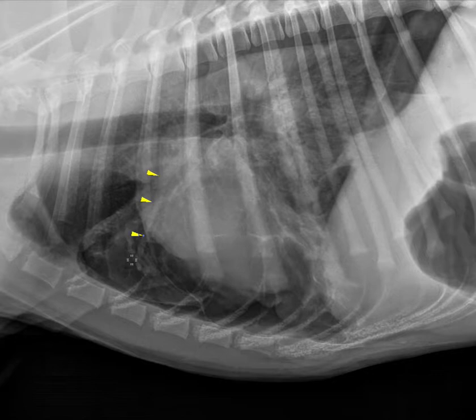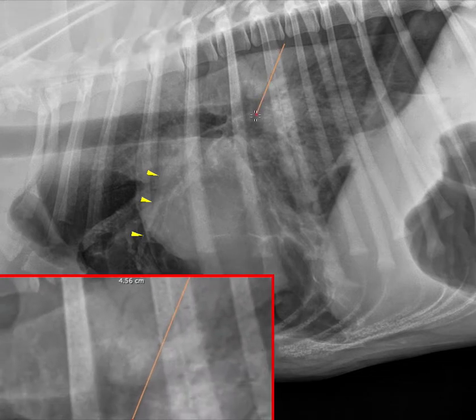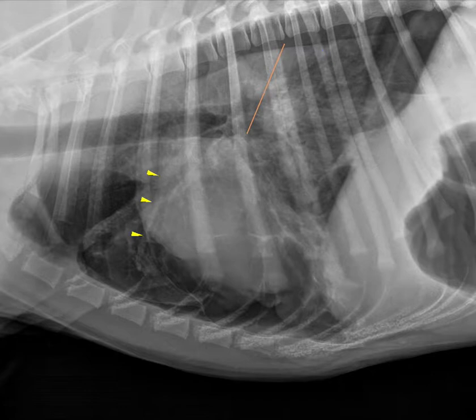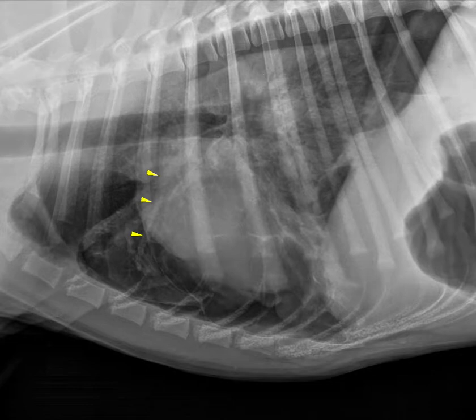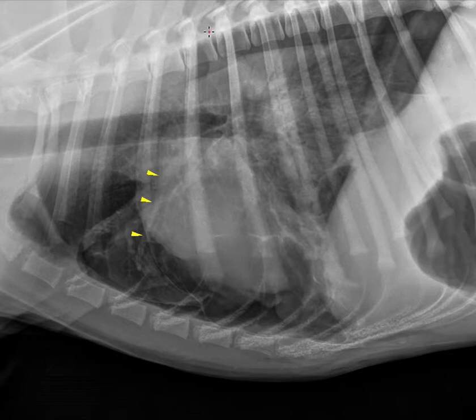The second anatomic feature I look for when assessing lung patterns is bronchi. Lines and rings might suggest a bronchial pattern, but those lines and rings need to be of soft tissue opacity. Here I've placed a line in orange to show an example of when a line is not a bronchial pattern — this line has a gas opacity. A line of gas opacity is not a bronchial pattern at all; it is an air bronchogram. This occurs when the bronchi maintain their aeration but peripheral to that, the lung lobe is not aerated — it's consolidated or has increased opacity due to pathology. Here we have several air bronchograms, and I'll point out a few with arrows.